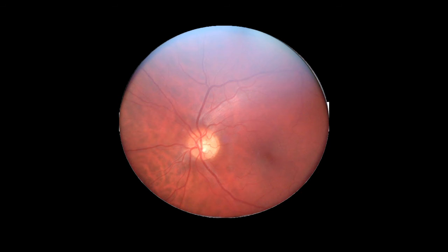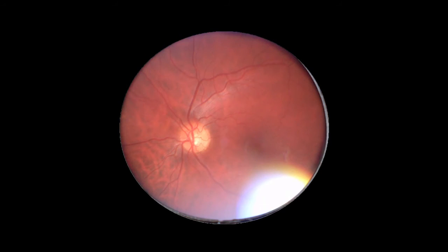Note: if you are seeing some white light at the top of the image you have taken, you need to push the device slightly further into the eye, compressing the eye cup more — this will prevent light entering the top of the eye cup. Conversely, if you see a white tail at the bottom of the image, the device is too close to the eye and you need to back it off very slightly.